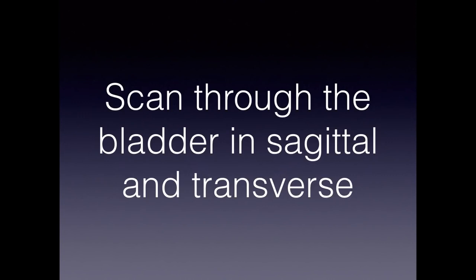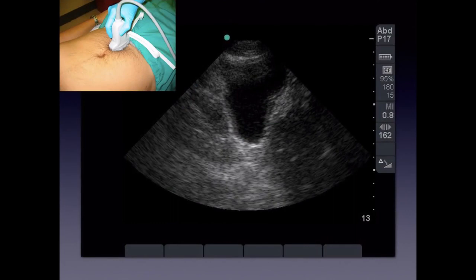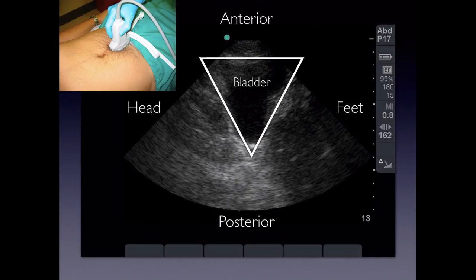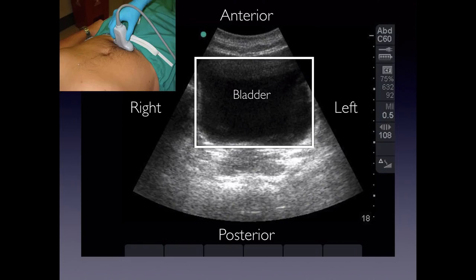To scan the bladder, place the probe right above the pubic symphysis and press straight in, angling back because the bladder sits behind the pubic symphysis. In sagittal with the indicator towards the patient's head, you get a triangular-shaped bladder view. We are on the anterior part of the patient, so the opposite is posterior. In transverse, rotate the probe with the indicator towards the patient's right to get a more rectangular view.